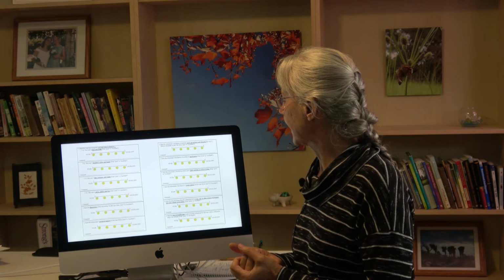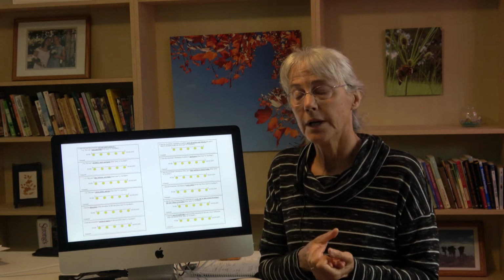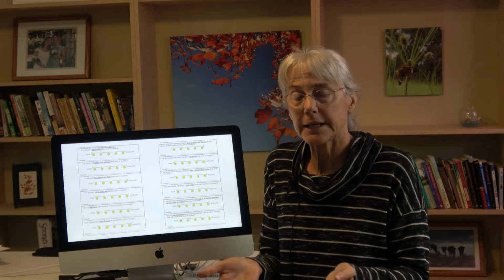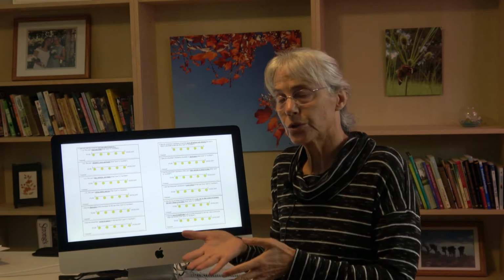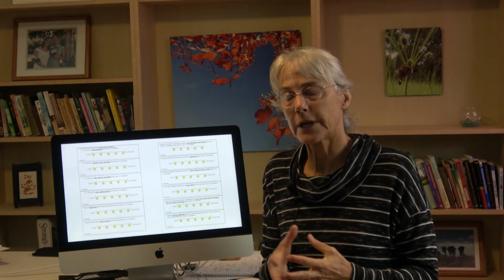Rate the ease of transporting this wheelchair in or on a car, van, or other means of transport this user is likely to encounter. In some places, this is actually a limiting factor. If the wheelchair doesn't fold, they can't use it because they can't take it anywhere at all. In other words, it can only be in their house or in school. Rate the ease of transferring in and out of this wheelchair for this user without help of an assistant. And this one is also a very important and universal aspect.